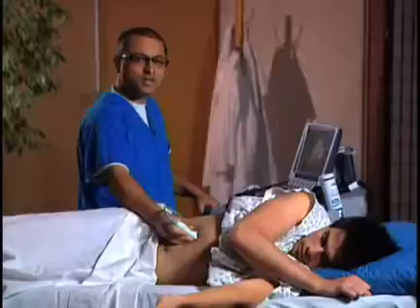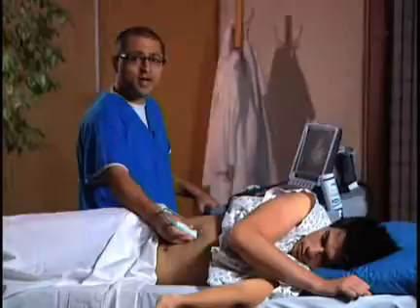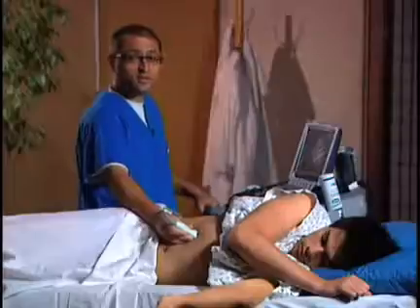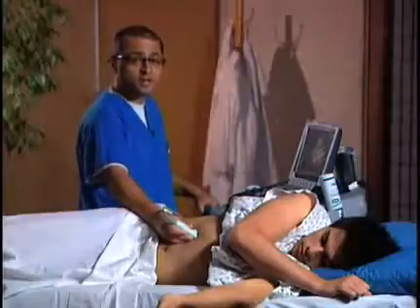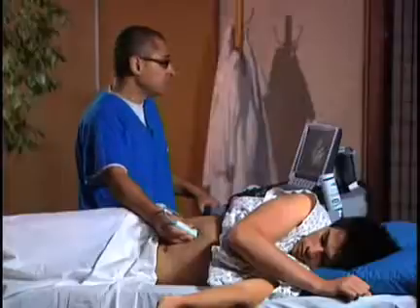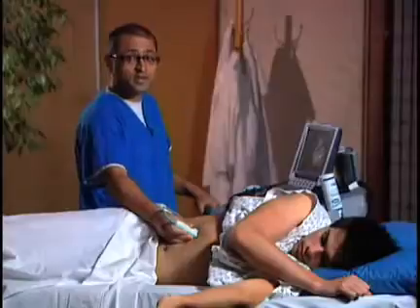So when you're scanning, you're going to be carefully looking for signs of a gallstone. A gallstone will have a hyperechoic appearance, meaning it's going to be brighter in nature, and it's going to cast a shadow. A key point here is make sure that the hyperechoic area that you're noticing actually lies within the gallbladder. A common mistake would be to identify an area outside the gallbladder that looks just like a gallstone, and that'll be a bowel shadow.